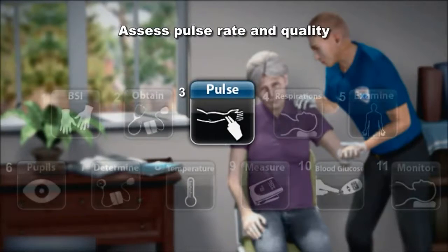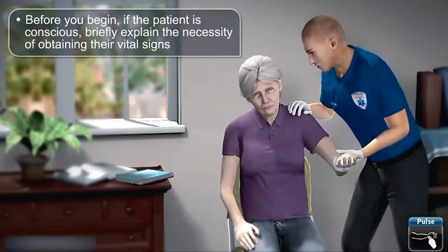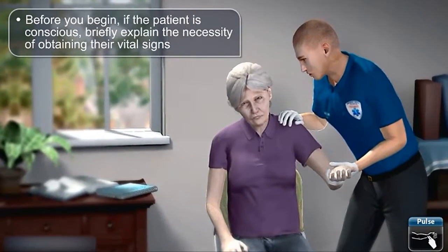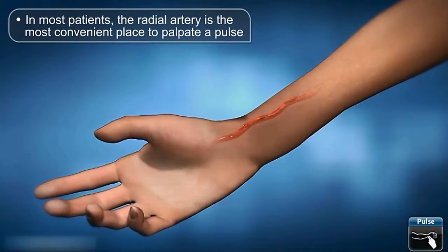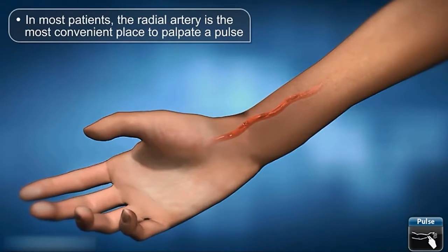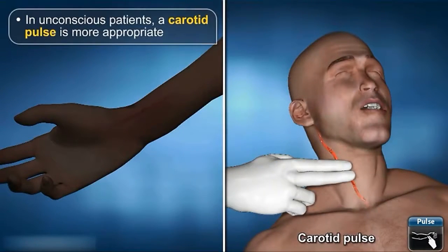Assess pulse rate and quality. Before you begin, if the patient is conscious, briefly explain the necessity of obtaining their vital signs. In most patients, the radial artery is the most convenient place to palpate a pulse. In unconscious patients, a carotid pulse is more appropriate.